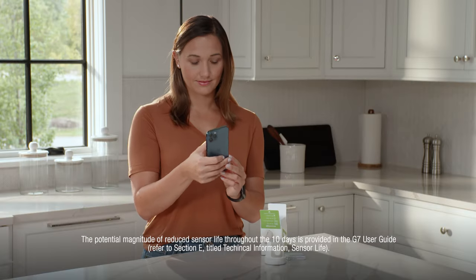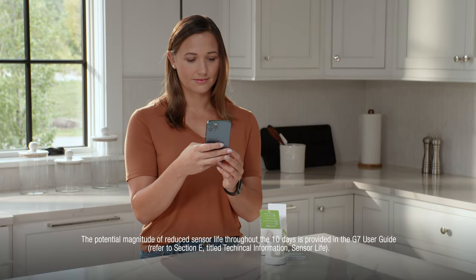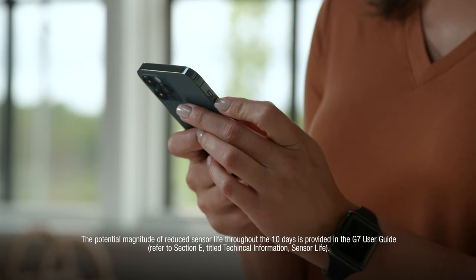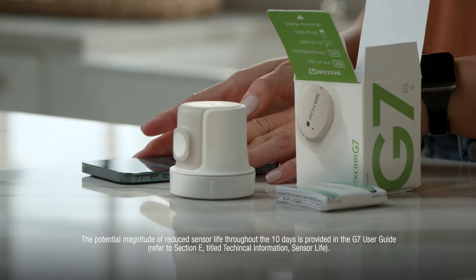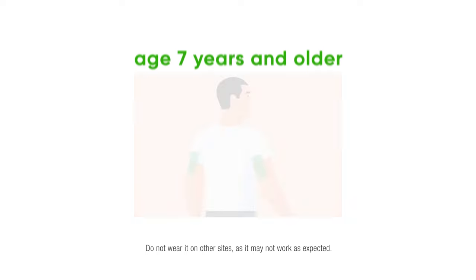Let's insert the sensor and apply the overpatch. Follow the insertion instructions carefully. Extra care may help you keep your sensor on for the entire sensor session. To insert your sensor, first choose your sensor site.